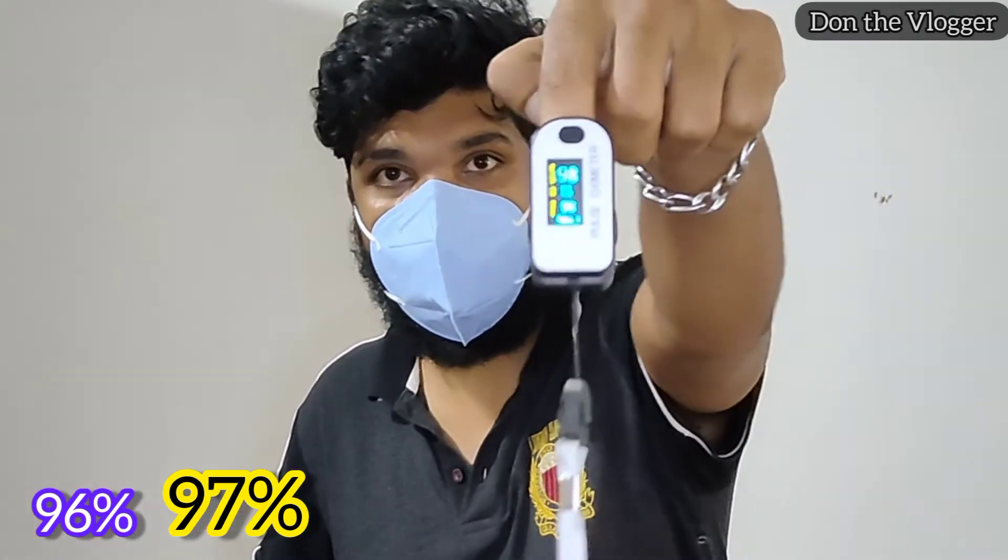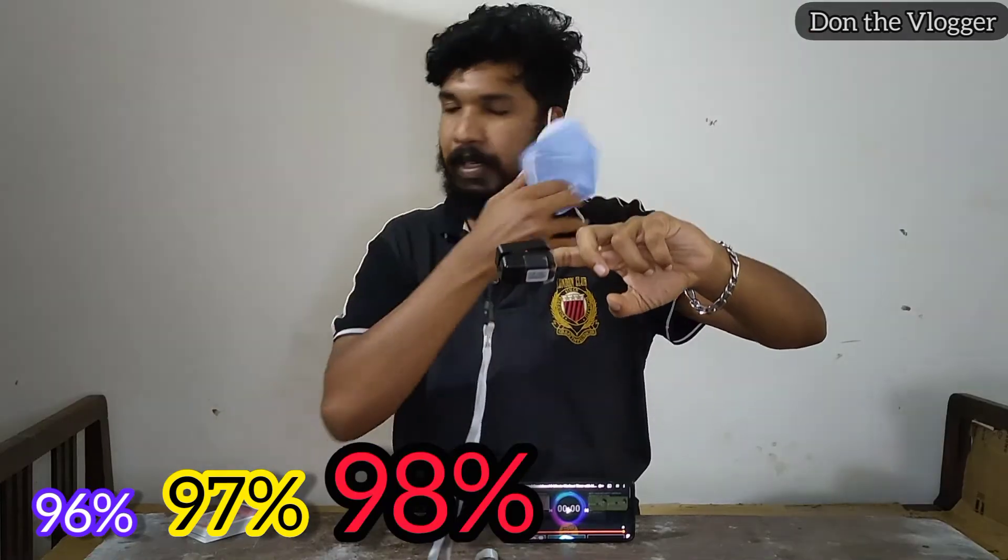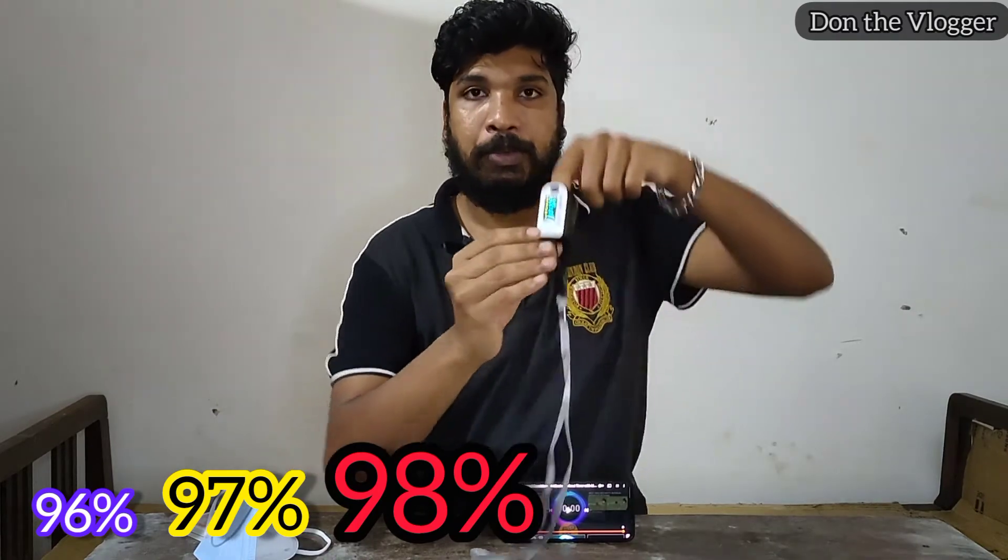Guys, the oxygen level is going up. It's going to be 92. I am going to use a mask. I am going to search for information about a mask and the oxygen level. I am going to use a mask and check the oxygen level and show you the results.